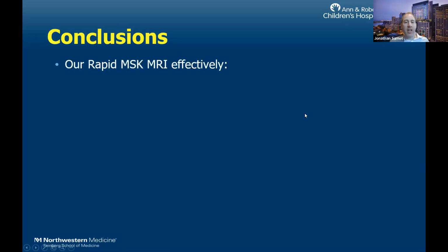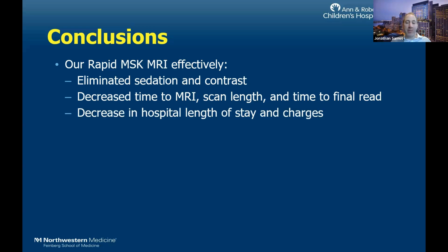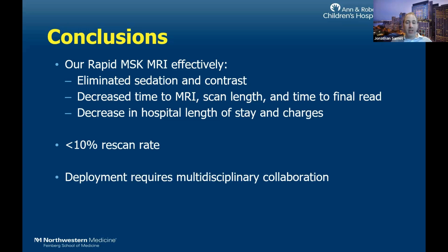So in conclusion, our rapid MSK protocol effectively eliminated sedation and contrast, and decreased the time to the MRI, the scan length, and the time to the final read. We decreased the hospital length of stay and the charges. We had a less than 10% rescan rate, and deployment requires multidisciplinary collaboration.